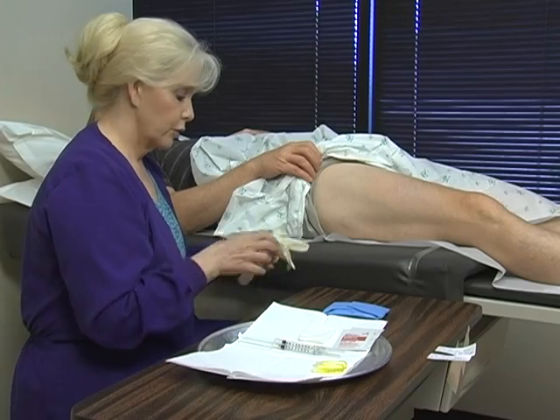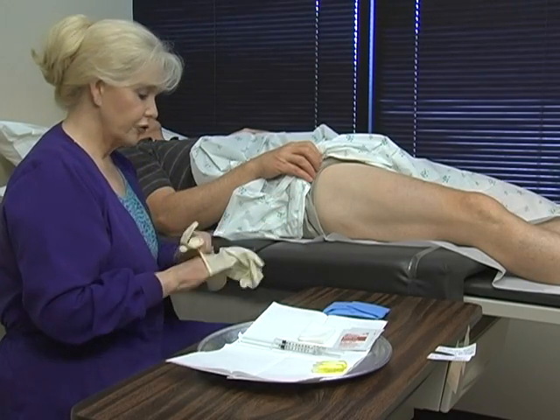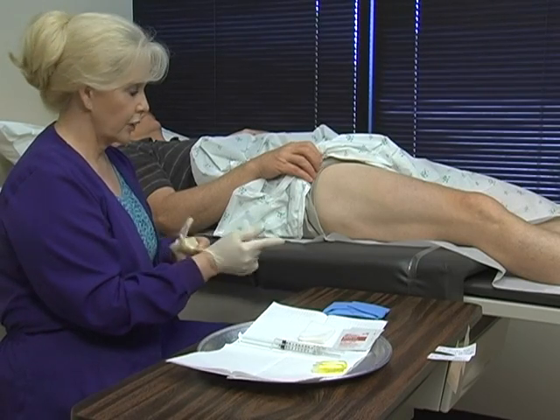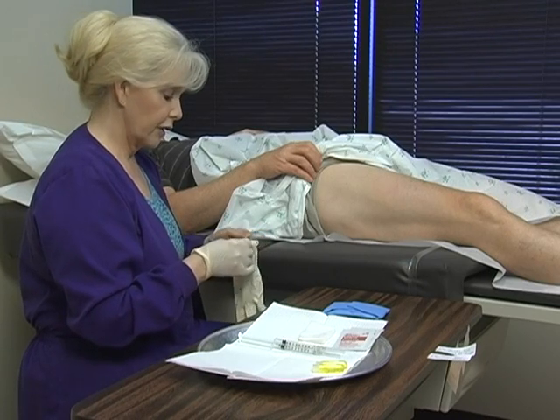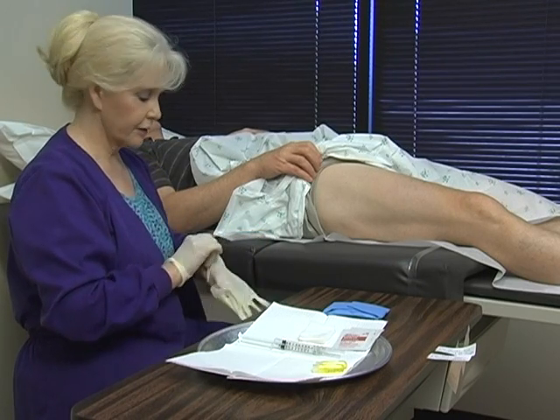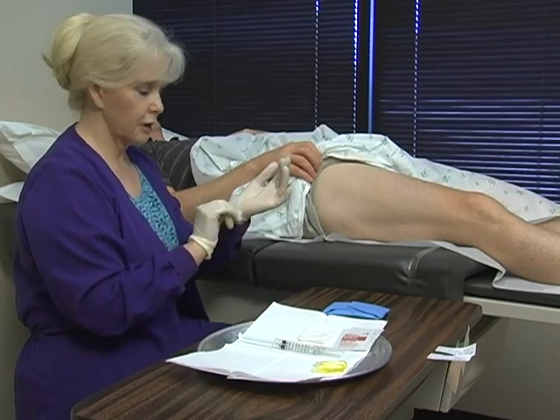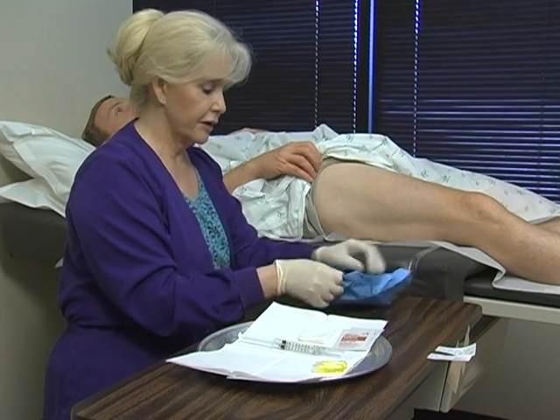We've already discussed with our patient to confirm that they have no allergies to lidocaine or epinephrine. It's also wise to find out if they have any allergies to latex. We use all non-latex equipment — gloves and even bandages — because there are so many patients that do have latex allergies.